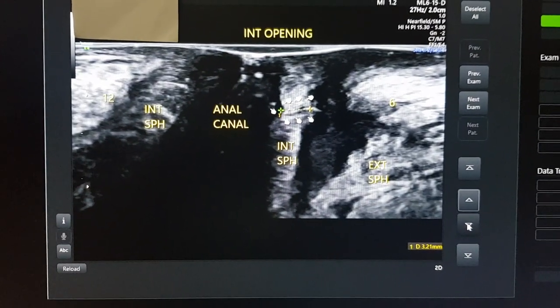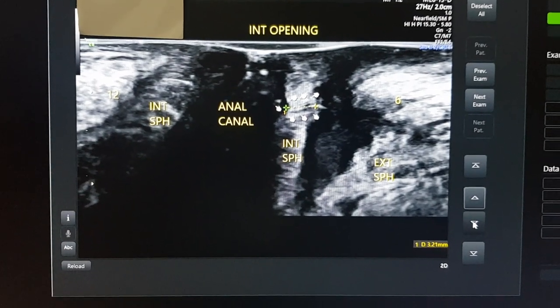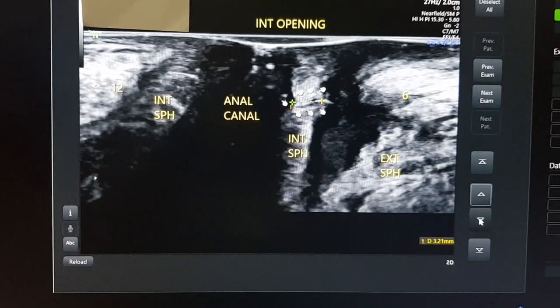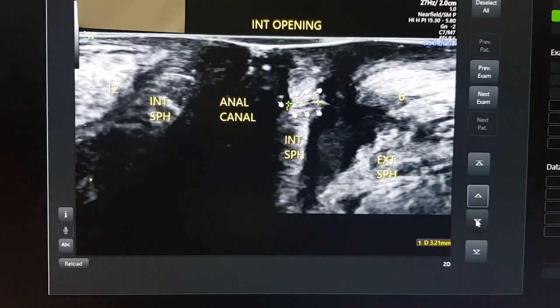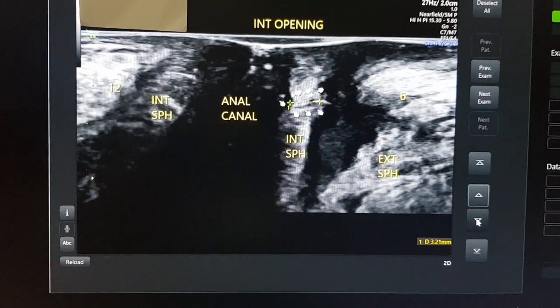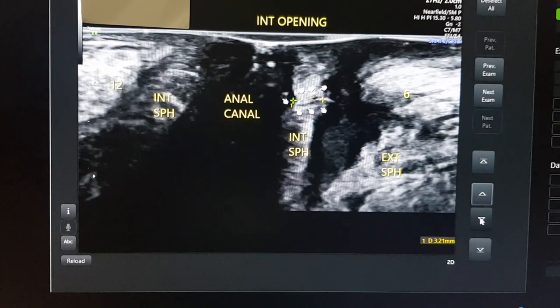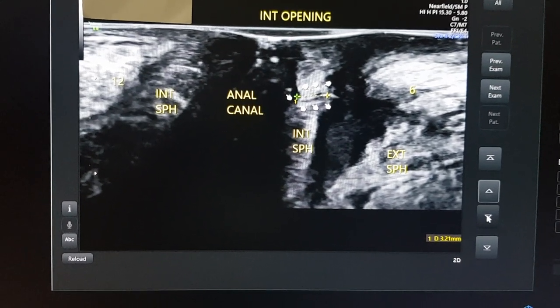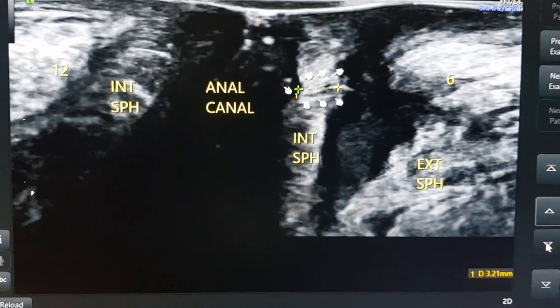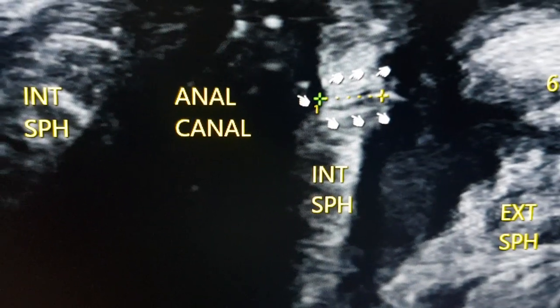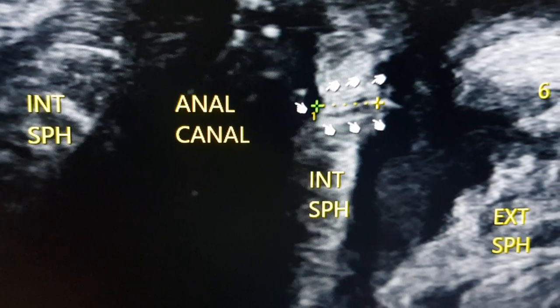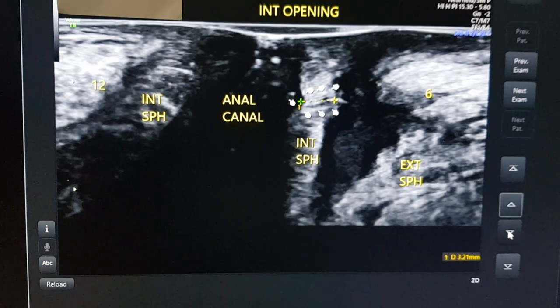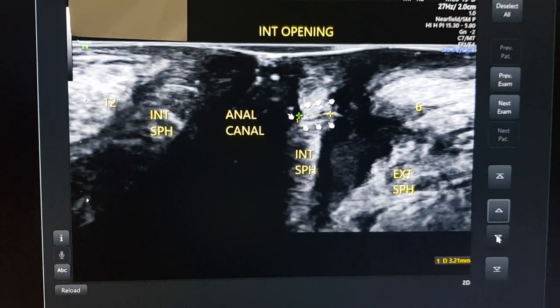After defining the external opening, tract, intersphincteric entrance, cranial ascent, and formation of the intersphincteric abscess, we now have to see where it is opening into the anal canal. You can see I have put arrows there which show the opening of the abscess into the anal canal at 6 o'clock position. There is the communication between the anal canal and the intersphincteric abscess. We have documented the internal opening.